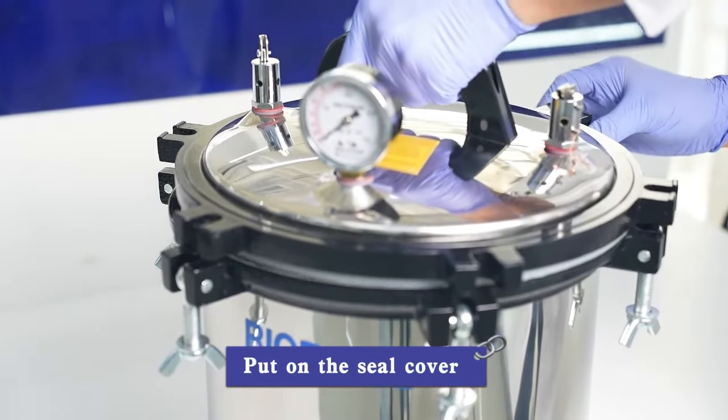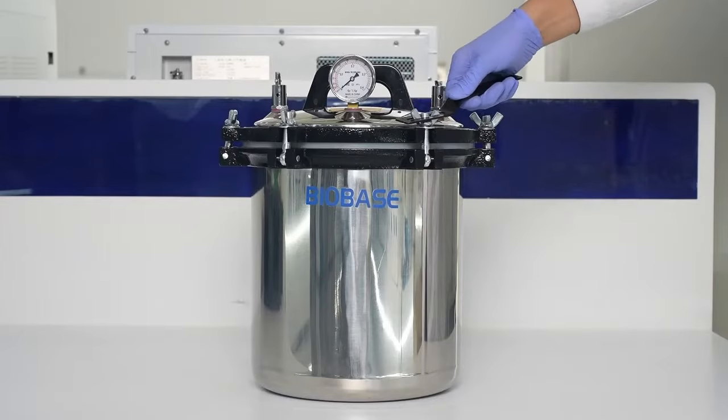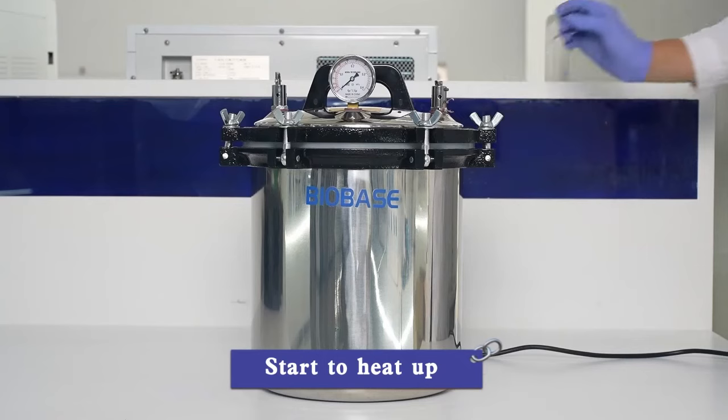Put on the seal cover. Close the six clasps and tighten the screws. Open the exhaust valve and turn on the power. Start to heat up.